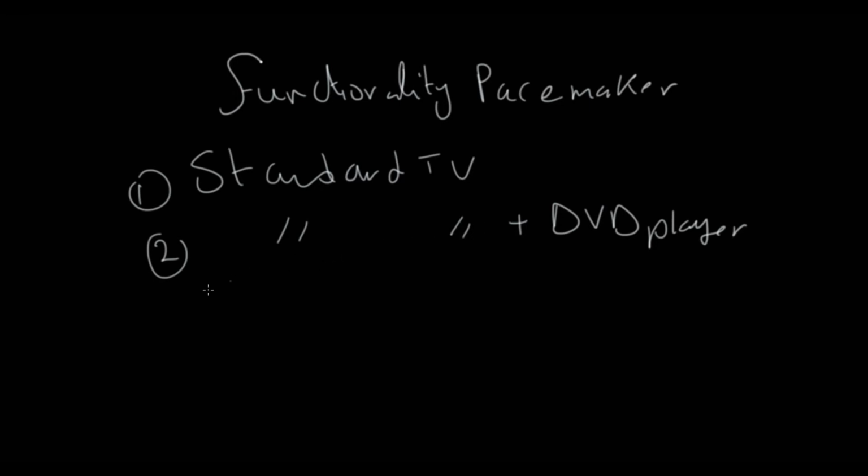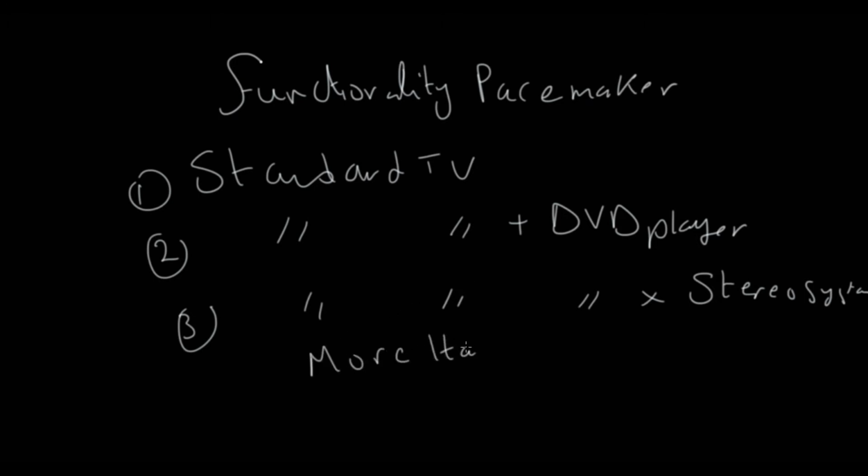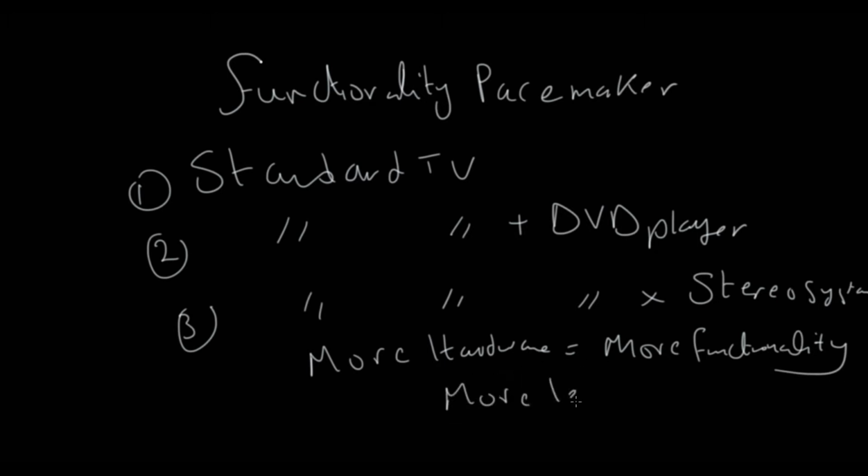And you can also have the standard TV, DVD player, plus a stereo system. So, more hardware equals more functionality. Same goes with the pacemaker. More leads equals more functionality.